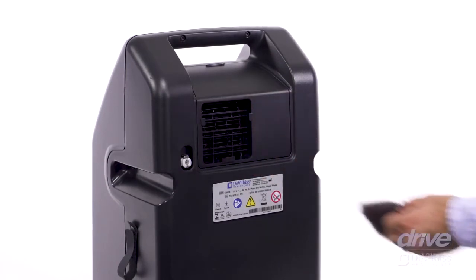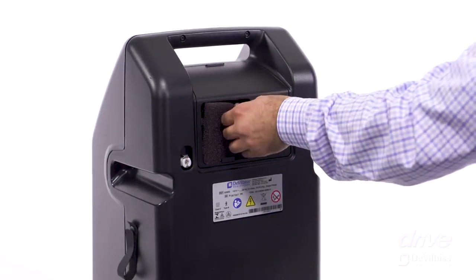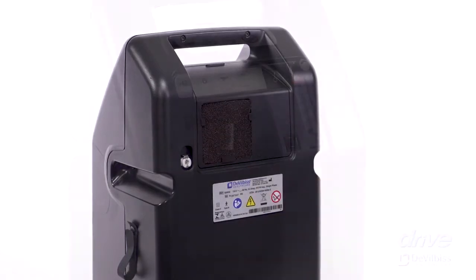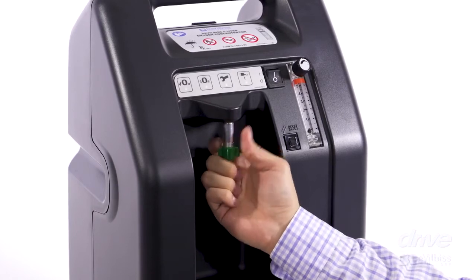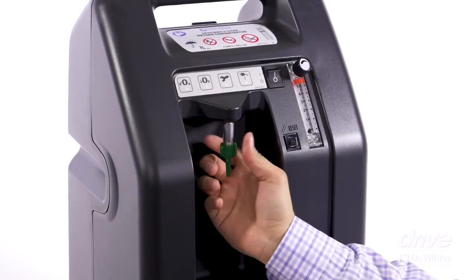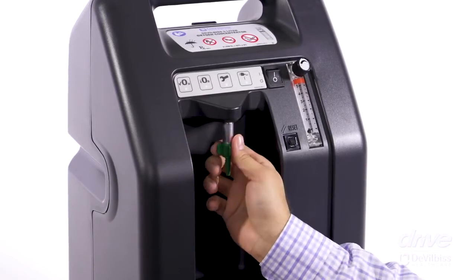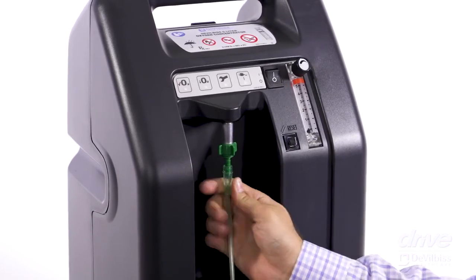Before first operating your unit, your provider will verify the air filters on the back of your unit are clean. Thread the oxygen outlet connector onto the oxygen outlet. Then, attach the oxygen tubing directly to the connector.